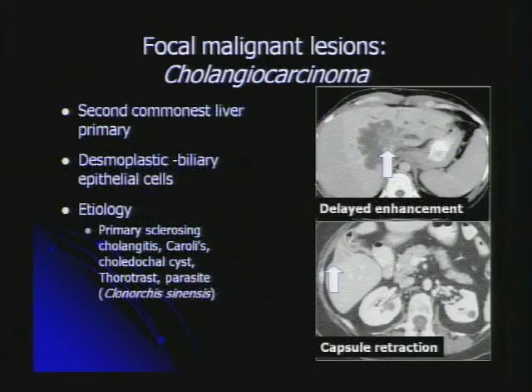There are many etiological factors that are in your syllabus. I won't go over them. Primary sclerosing cholangitis and Caroli's disease being examples. So here you've got an ill-defined tumor.